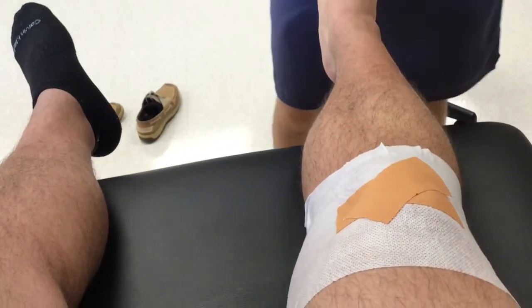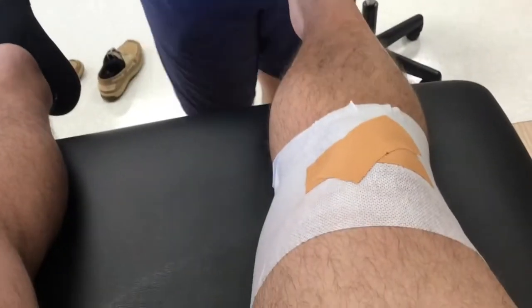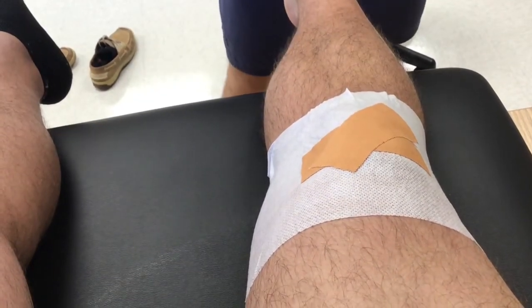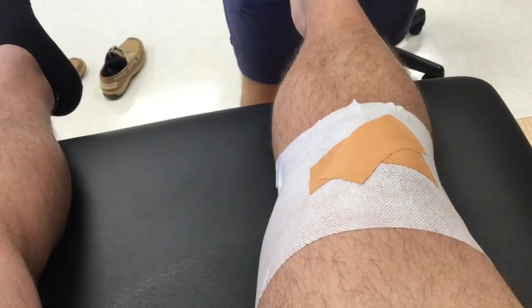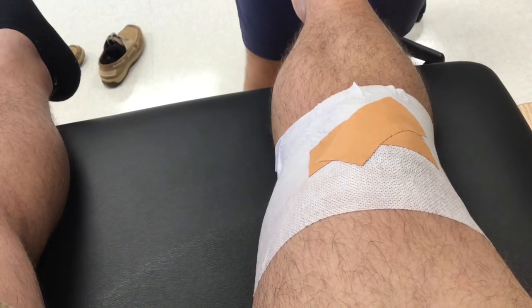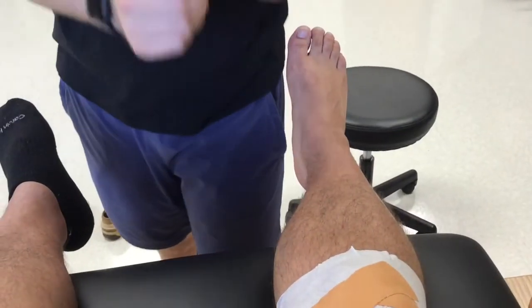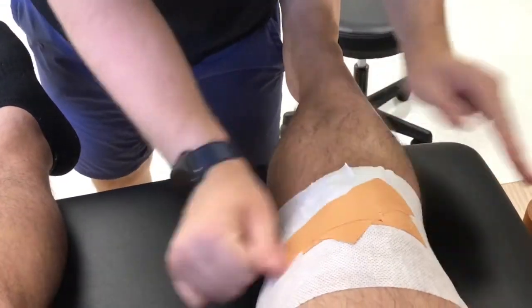This next one is going to be a tilt correction as well. I'm going to put it right on top of the kneecap and pull him medially. So the same thing as the first strip, except this time I'm right on top of the knee. So right there on top, and then we're pulling him medially.